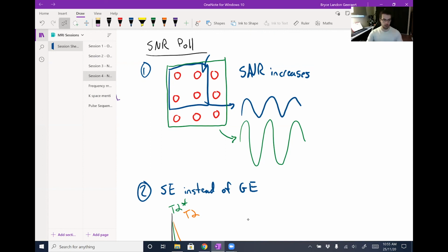So you're right that having a larger voxel would mean that an imperfection in the magnetic field, for example, would affect more tissue in that voxel and might draw the gray scale or the lightness of that pixel further away from biological accuracy, but that's not noise. That's a different kind of artifact that we're not considering in the signal to noise ratio. We're just considering random errors due to machine imperfections at this point, which looks more like random ups and downs.